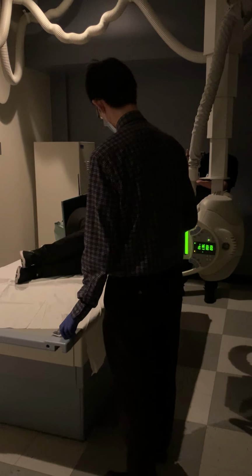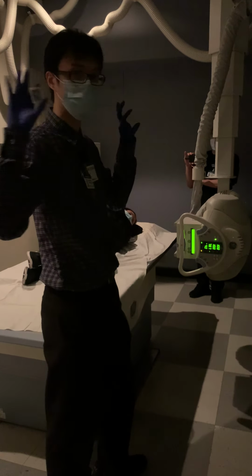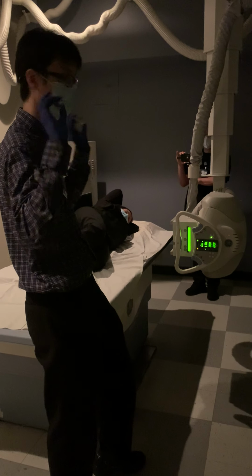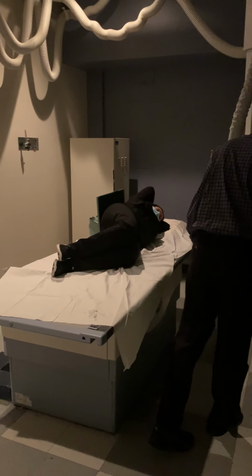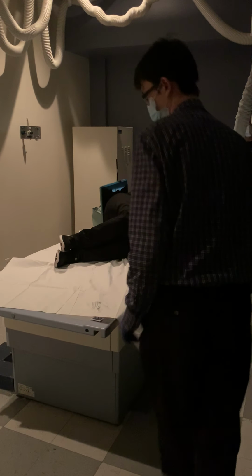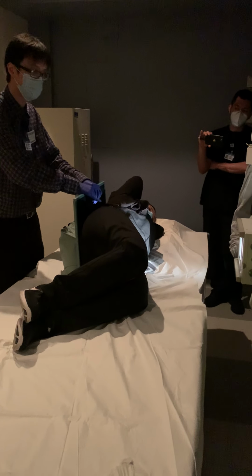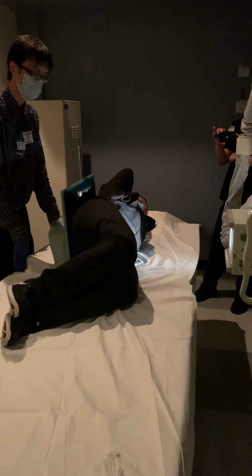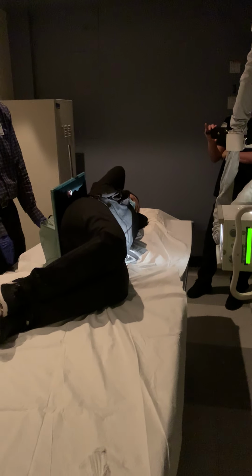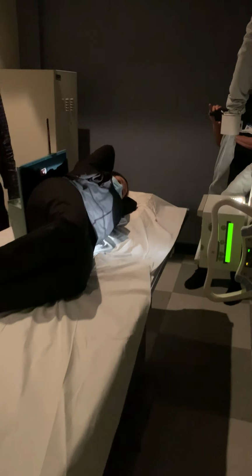What else do we need? We need a marker. Which marker are we going to use? The right. Good, right marker, because right side is up. So I'll just take this. I'll look for any area with light. Got some light over here. Just take my marker right there. And there we have it. Our lateral decubitus abdomen. Left lateral decubitus abdomen.